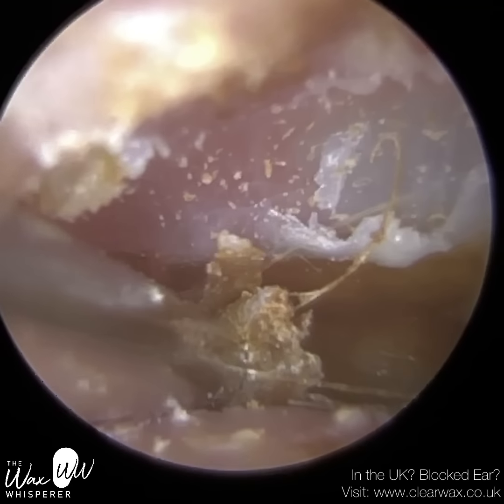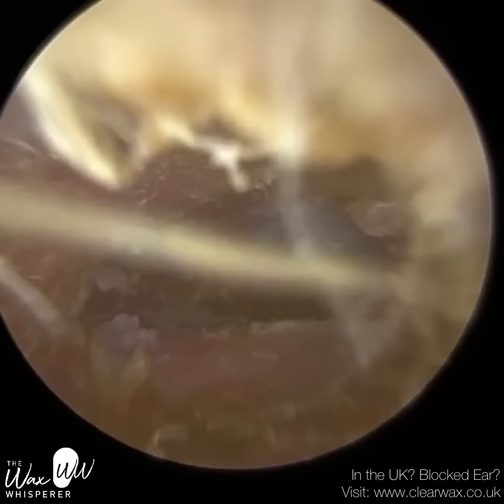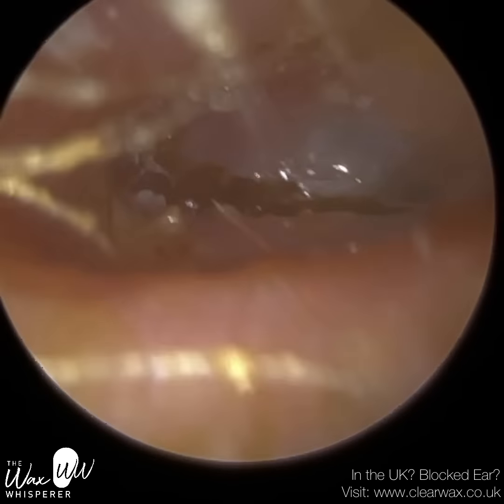Now, with this patient, this skin is failing to migrate off the eardrum, and instead it's almost folding back upon itself. And there's actually three layers.